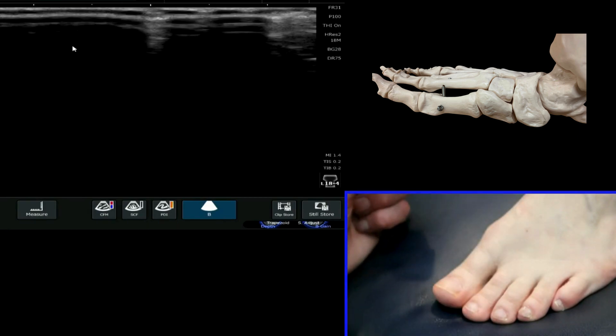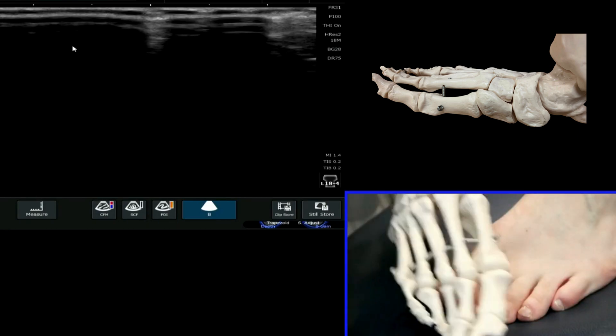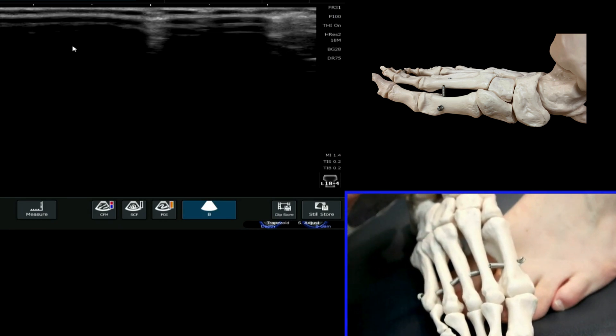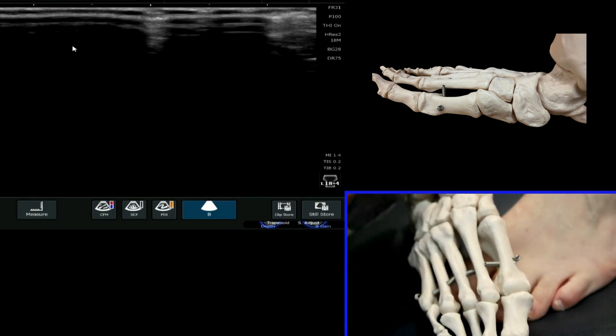We're now going to have a look at the metatarsal shafts. If we look at the skeletal anatomy before we do this, we can see very clearly the length of the shaft that we need to examine, and we can look at this in both a short axis but also a long axis view through this region.